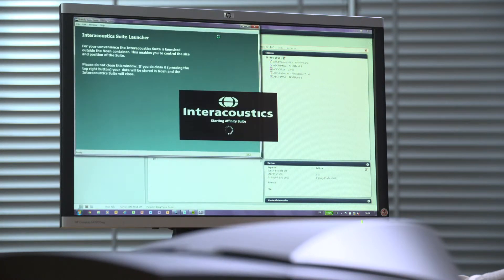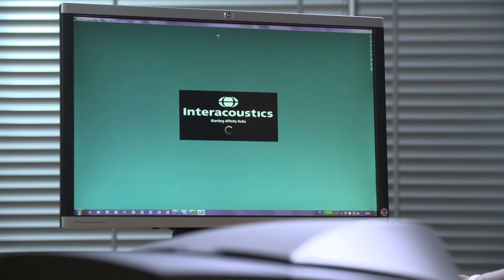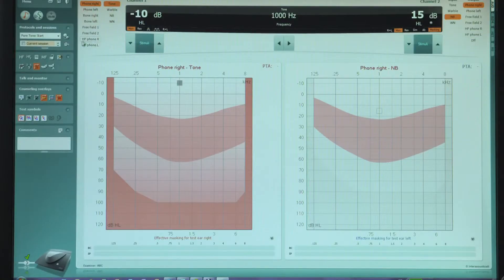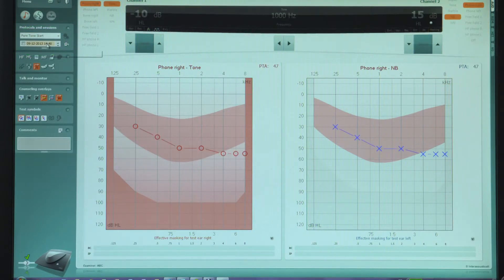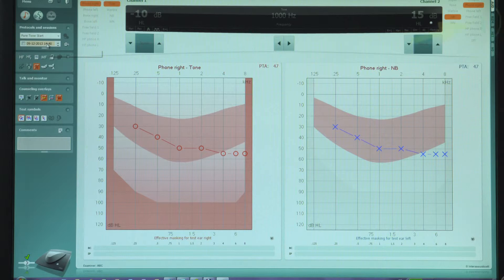The Affinity Suite will launch in the audiogram screen. The first step is to select a previously saved audiogram for the active session. An audiogram needs to be active in order to have targets displayed once we go into the Real Ear Measurement screen.